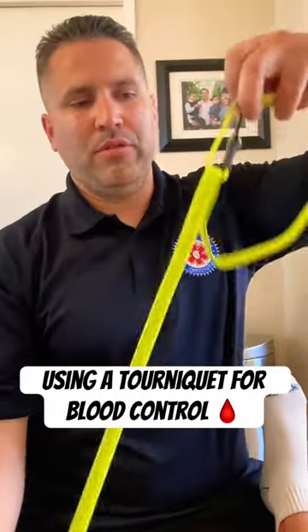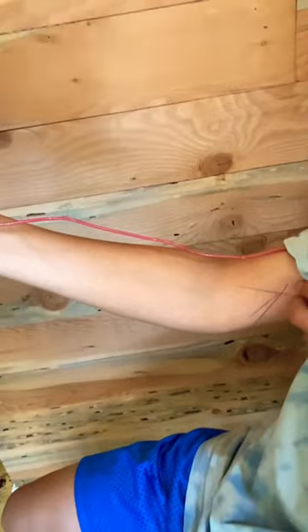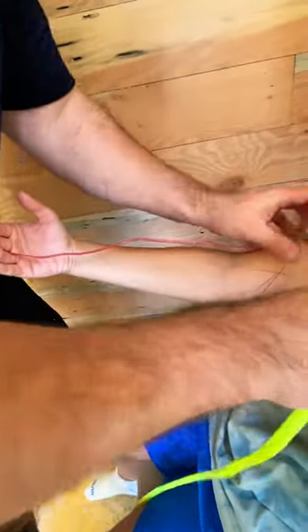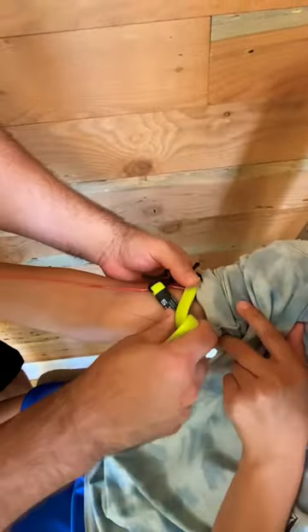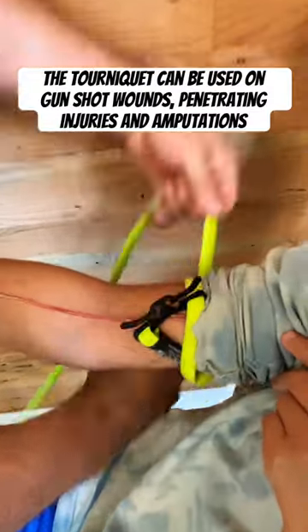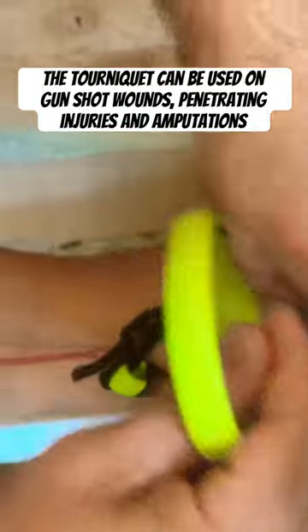Put a three-finger loop right through to create your opening. We're going to wrap the tourniquet. Put it two to three inches above the wound and make it tight. Wrap it a minimum of three times.